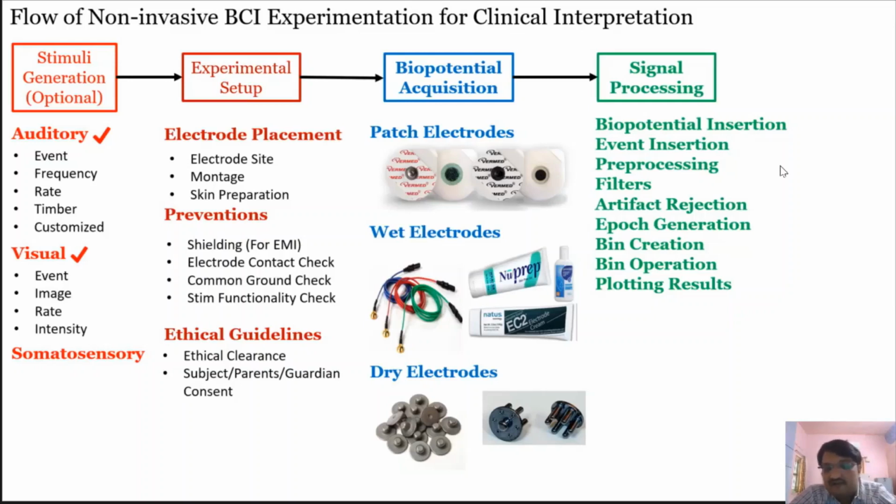Also, as I mentioned, you would have used a notch filter or band stop filter to combat power line interference. You can again use one notch filter for safety in your software, if you are not using it in your electronics or hardware. Generally, all modern EEG acquisition devices have the option of keeping the notch on for both frequencies, 50 hertz and 60 hertz.